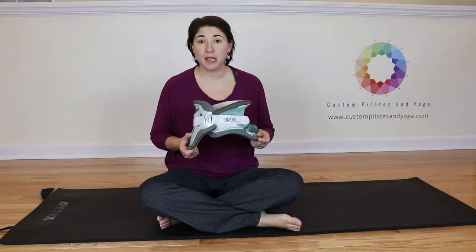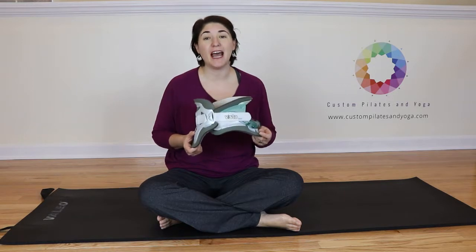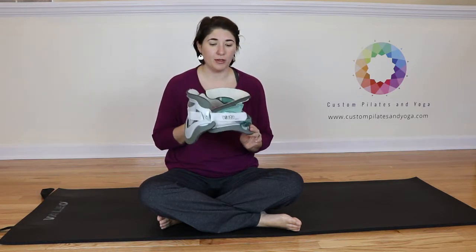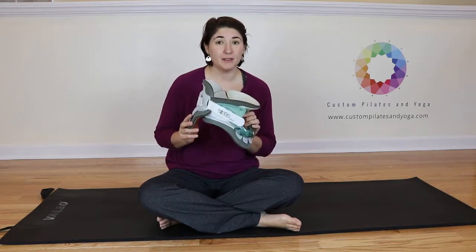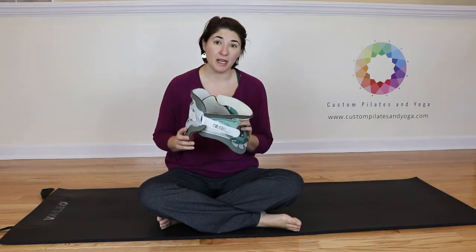Hi, I'm Sarah with Custom Pilates and Yoga and today I'm going to discuss how to adjust the Aspen Vista Collar. Now this right here is my own collar. When I broke my neck June 30th of 2017, this little beauty is what they put on me in the hospital and I got to wear it for three months.